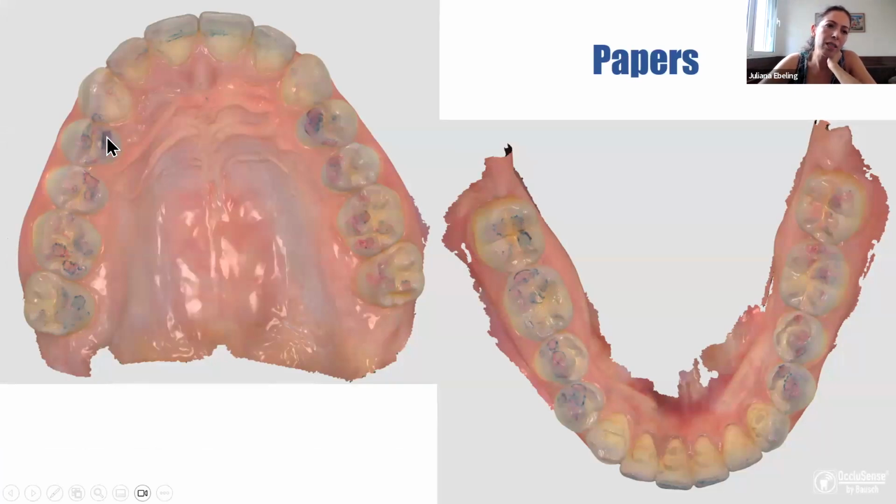But when I look at that, I ask myself, is this contact more intense than this one? Is this contact more intense than this one? It's very subjective. And I don't know when these contacts happen. I just have a representation of the summary of what happened during the whole movement. And our brain was trained only to look at that.